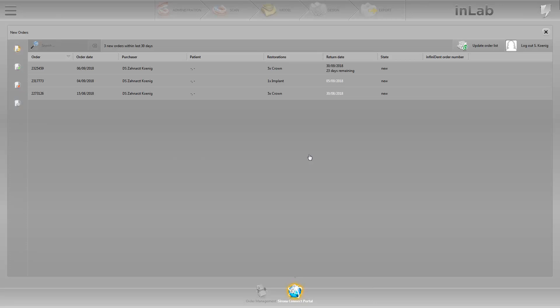To continue, we mark the new order and various buttons are displayed at the end of the line. The first one shows the chat history between the clinic and the laboratory. In order to check the order or models, we select the second option, check order.